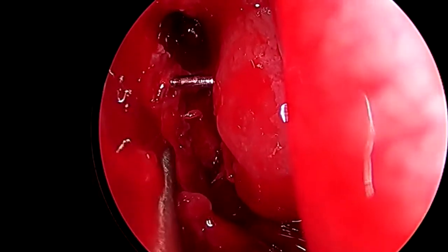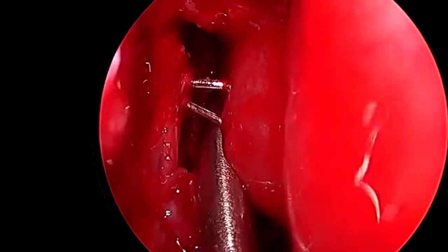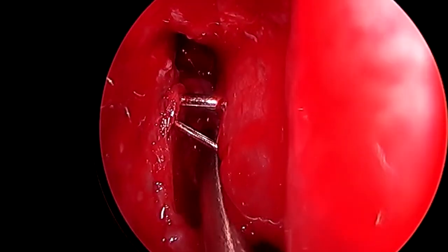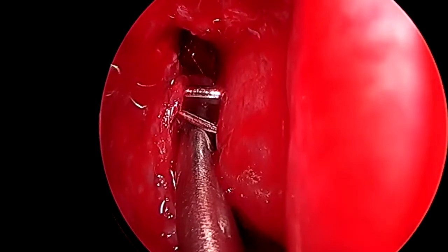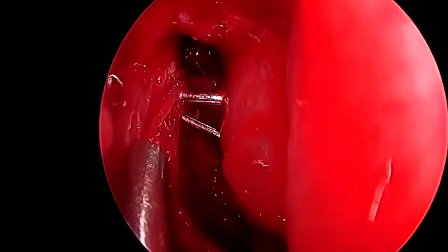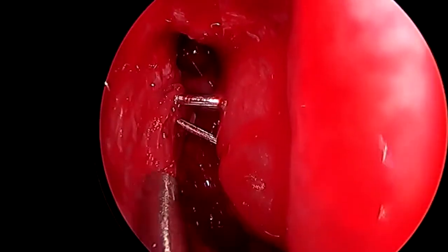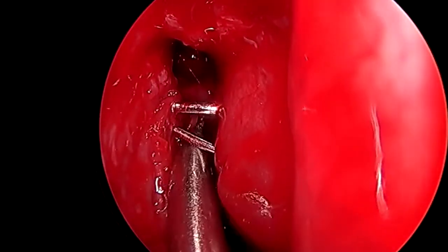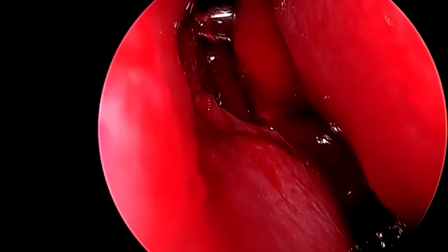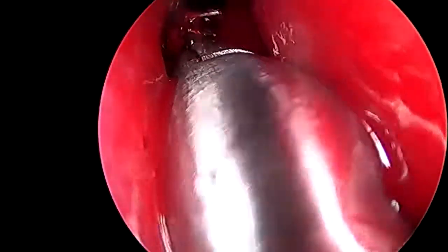Obviously this is unique in that the lacrimal sac has been previously opened in the person's first surgery. Now we can see the common canaliculus is well visualized with intubation through the superior and inferior system.